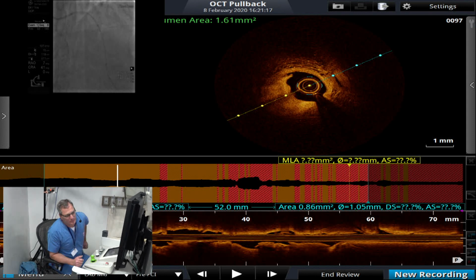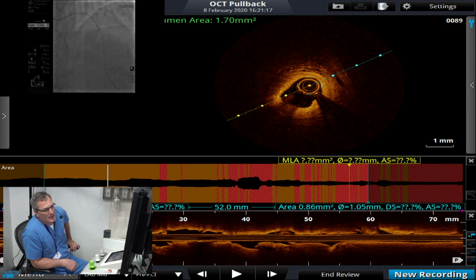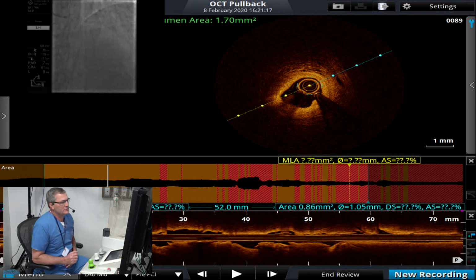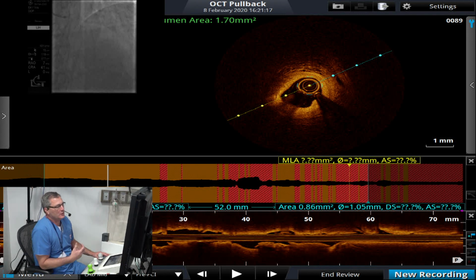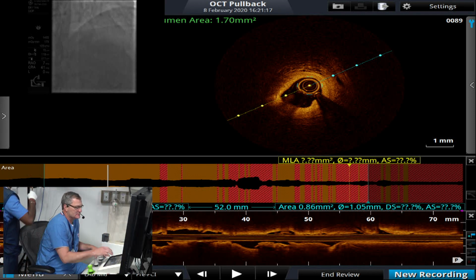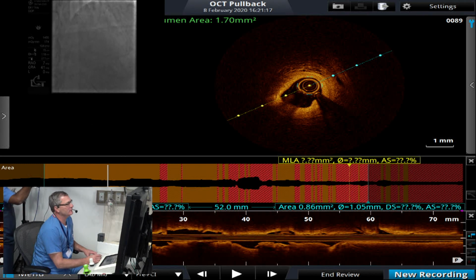So the point is, you can do hybrid robotic procedures and not spend an awful lot of your time in the cockpit. I have a really heavy CTO practice, do about 150 CTOs a year, and initially thought the robot didn't belong in complex procedures like CTO. Then I started doing CTOs and realized we would spend 40% of the procedure time in the cockpit, and that's on an average 89-minute procedure, which to me adds up a lot over time. So they've loaded up my balloon, my 2520 NC.